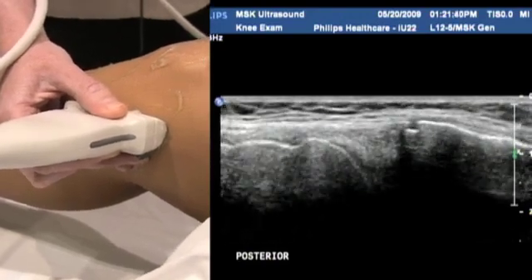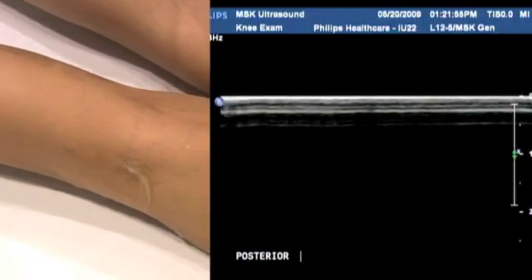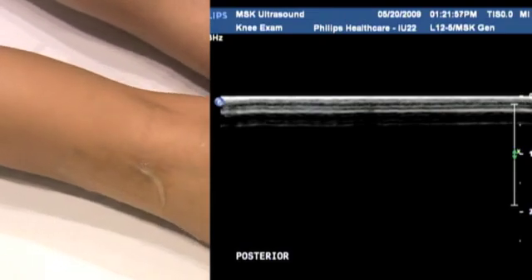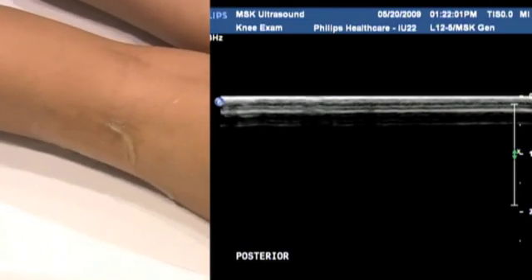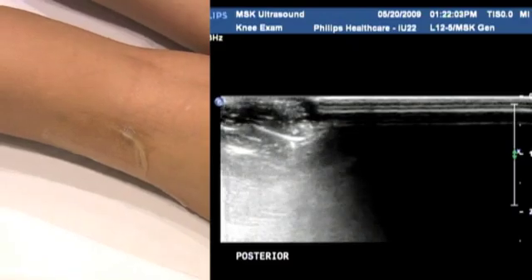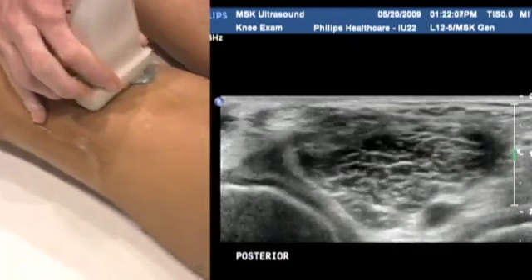So if I can just ask you to roll up onto your side, slightly facing that way. Perfect. So again, if the patient's difficult to move around, it's perfectly fine to attack this from the side. Again, you're going to get a better overview if you can get the patient prone. So that's just something to be aware of. So posteriorly now.